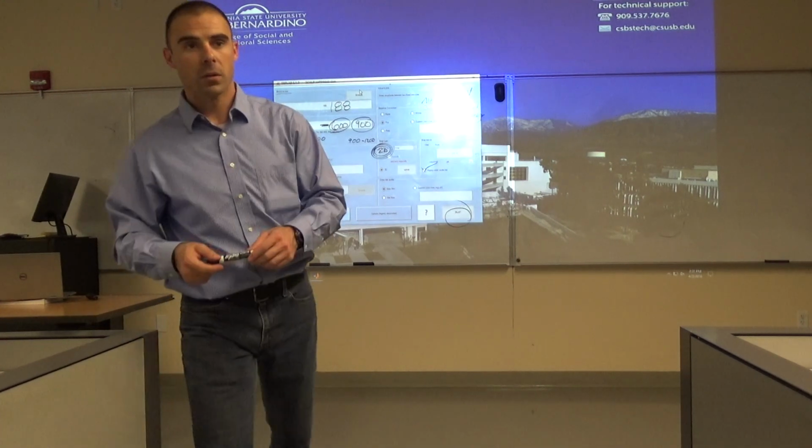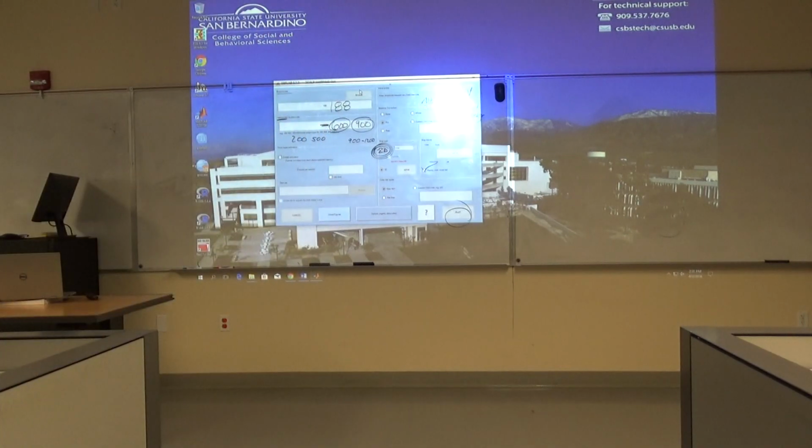What did the bins mean again? The bins are actually conditions in our memory experiment. So you know our memory experiment a little bit. So you can hit browse there, and it should give you a list. We're on 188, so scroll down to 188. You're subtracting the difference between when they said old 5 versus old 4. Oh, that's the difference then. It's recollection, familiarity. Yeah.